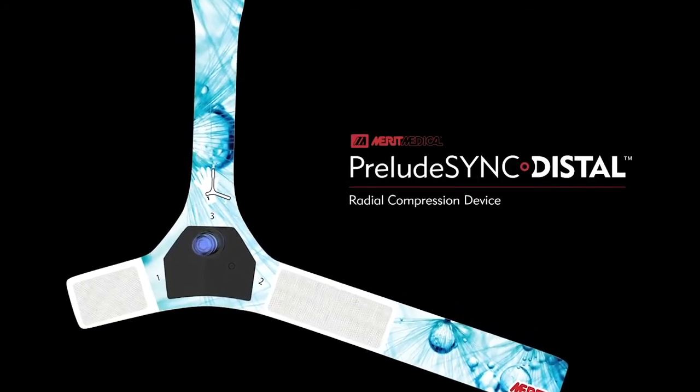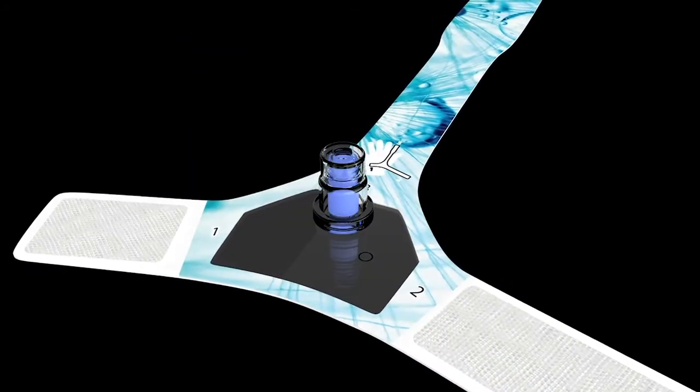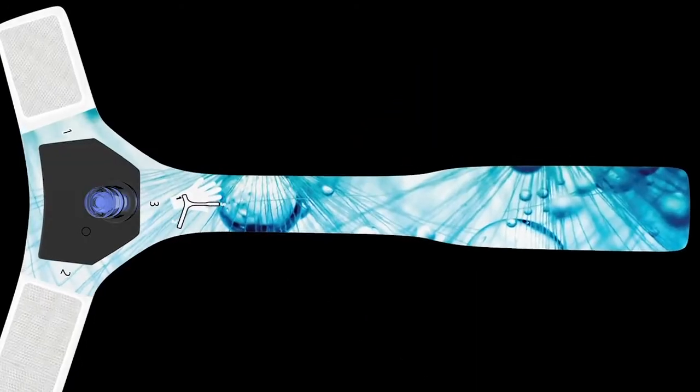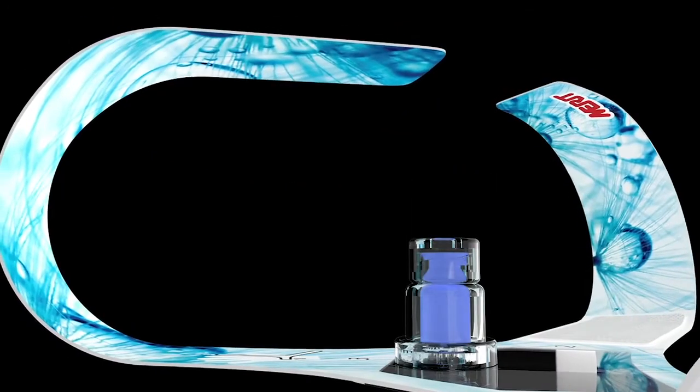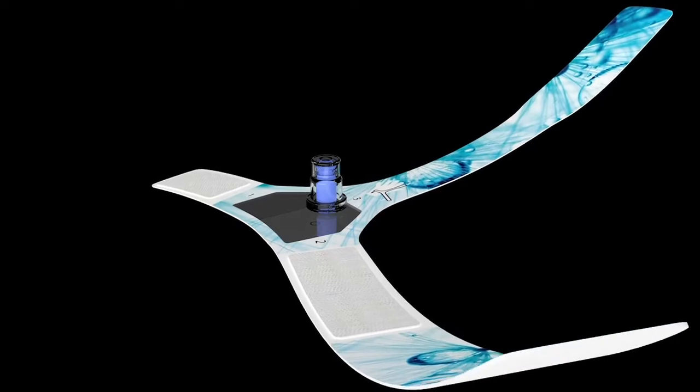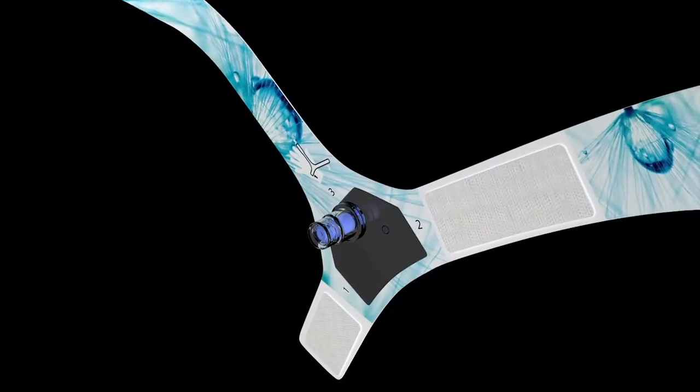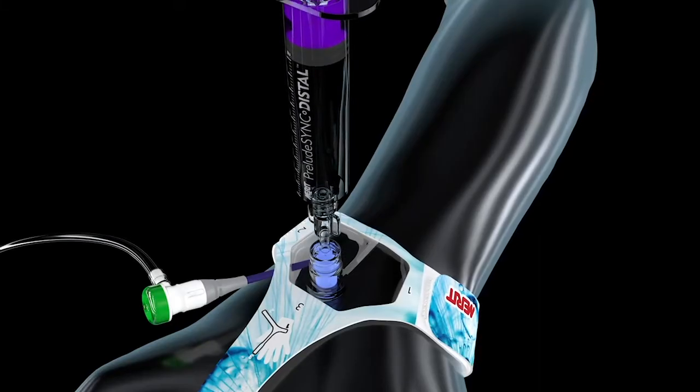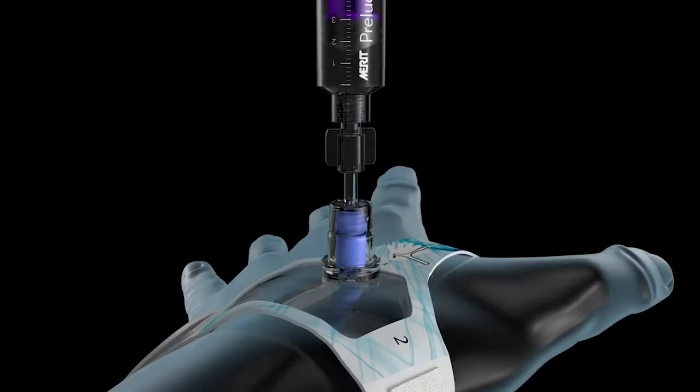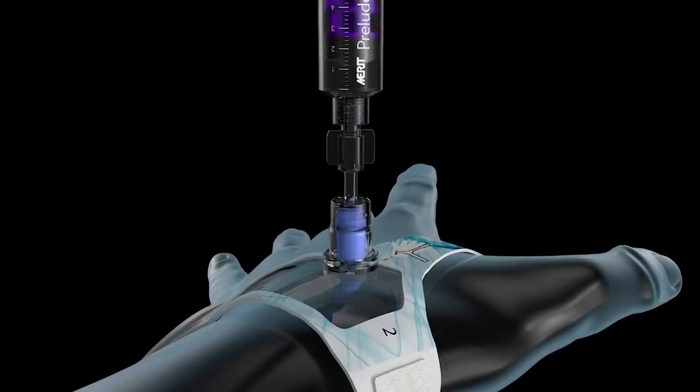The Prelude Sync Distal Radial Compression Device is used to gain and maintain hemostasis of the distal radial artery. It has a soft wristband and thumb saddle strap with secure hook and loop fasteners. The band delivers adjustable compression of the puncture site with an inflatable balloon and a check valve for easy inflation and deflation with a syringe.